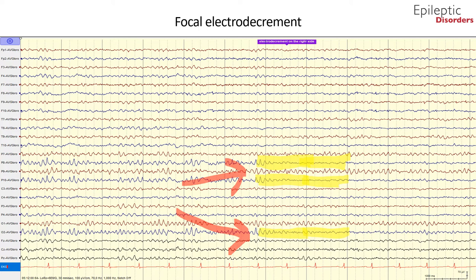Additionally, intracranial recordings show that this phenomenon occurs when low-voltage fast activity is observed on the intracranial contacts. Because of the very small size of these signals, they do not cross the scalp, and what you observe on the surface is the disruption and cessation of the previously ongoing background activity. If we zoom in on P9 and P10, you can see the alpha rhythm is replaced by very low amplitude, high beta activity.